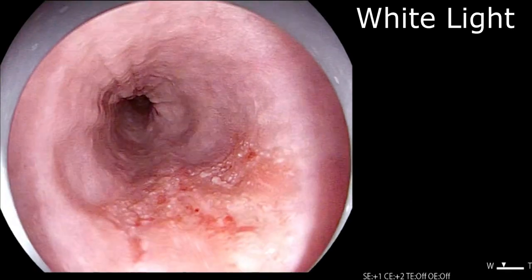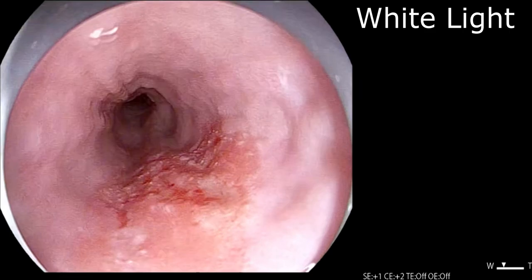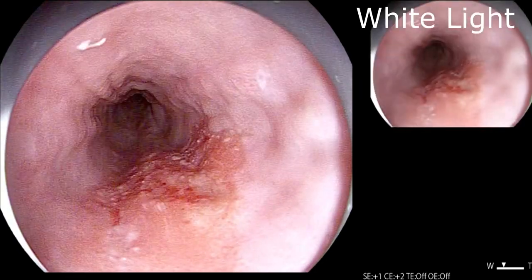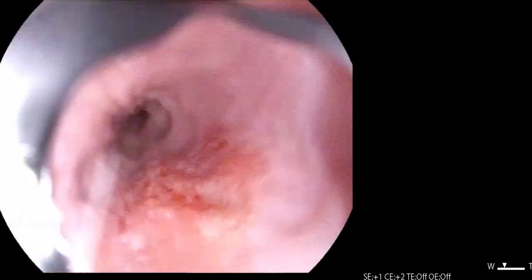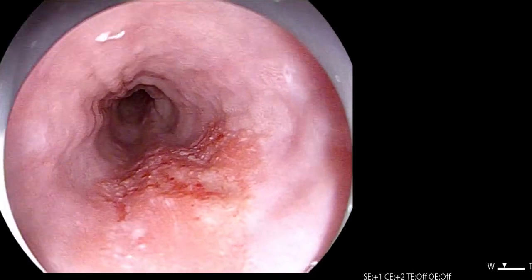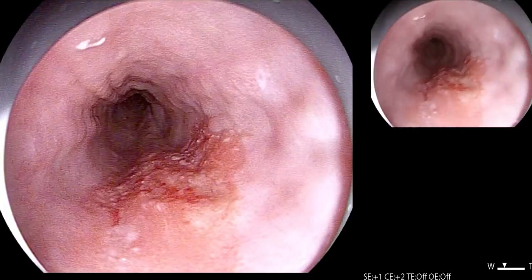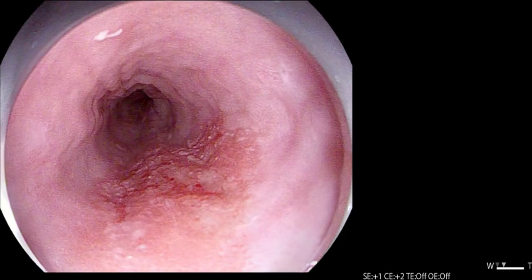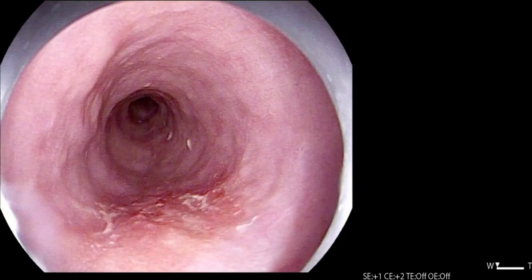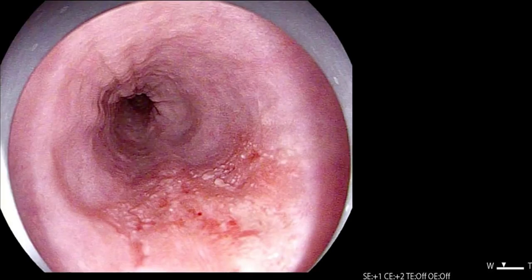White light demonstrates a slightly red Paris 2A plus 2C lesion approximately 27 cm from the incisors. Other than the clearly depressed area, no other high-risk features such as nodular protrusion or poor tissue pliability with insufflation and deflation were present.